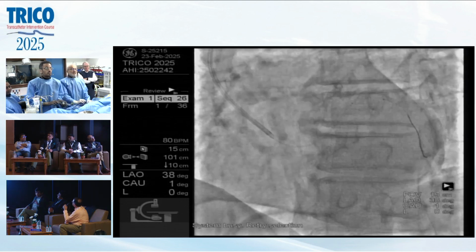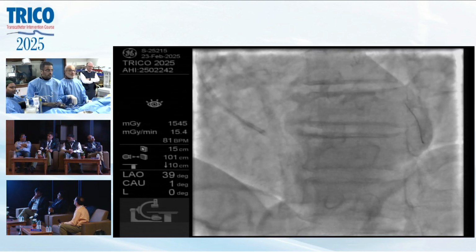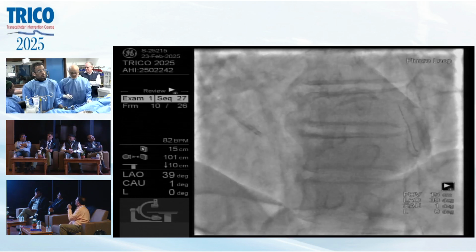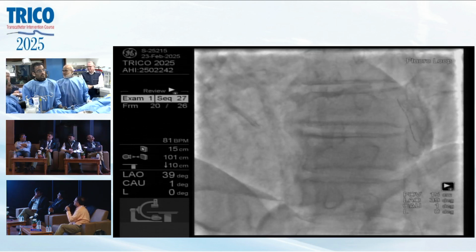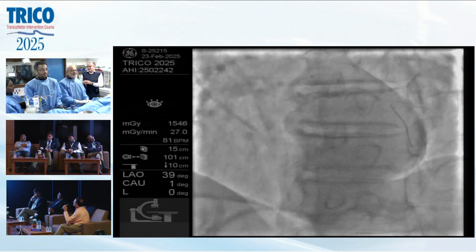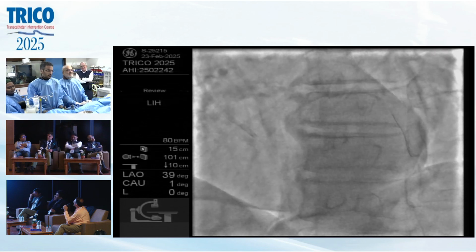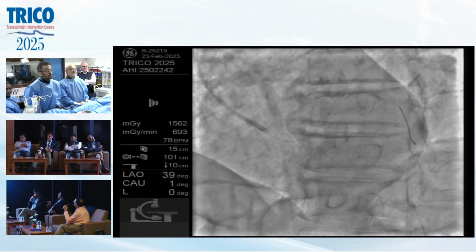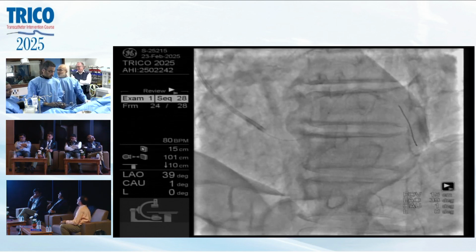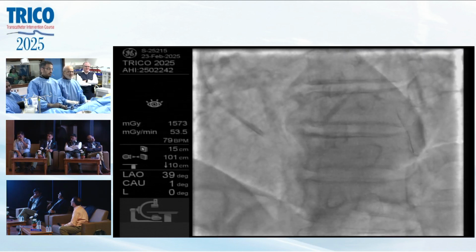Yeah, you can dilate here also now. And we can dilate 15. Deflate. And that's the 3.0 balloon, right? Stent enhancement, StentBoost or something, we will never use it, right? I was just thinking maybe a poor man's OCT, just in terms of stent expansion. Probably they are not well versed with it. We have never used it. It must be there in the system. Deflate.